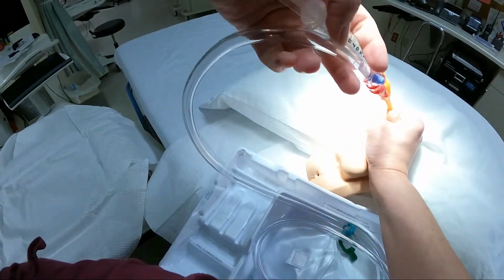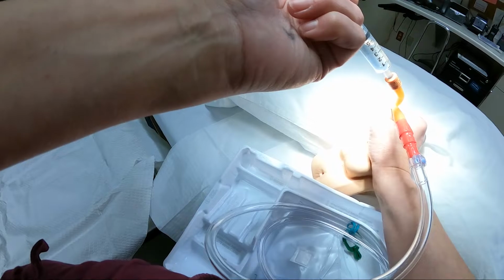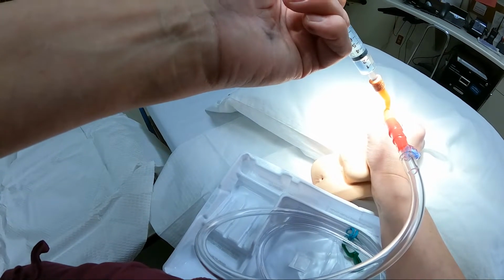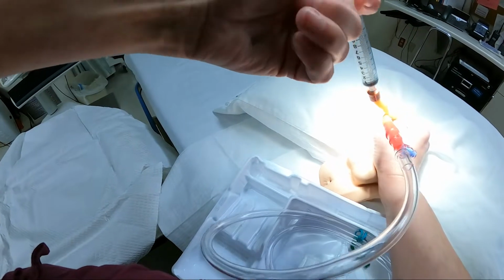So, up to the bifurcation. Then you keep your hand here while you're putting the fluid in. The purpose is so that you can feel if a balloon is blowing up in the penis, because you don't want that. You tell your patient beforehand it should not hurt. If they start yelling, whoa, whoa, whoa, stop. And you will hopefully see urine.